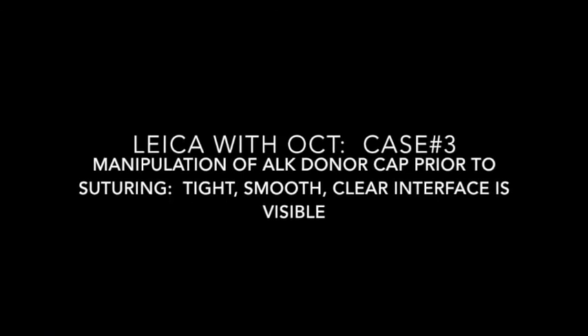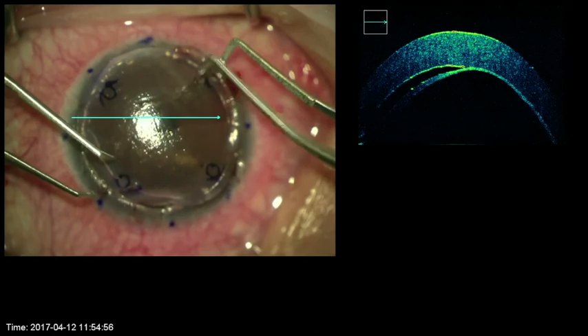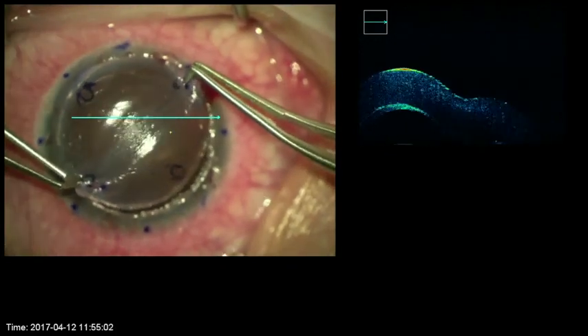In this case, the donor cap has been lightly placed over the recipient bed and the OCT shows the area of separation. As the donor cap is pulled tight, adherence is quickly achieved.